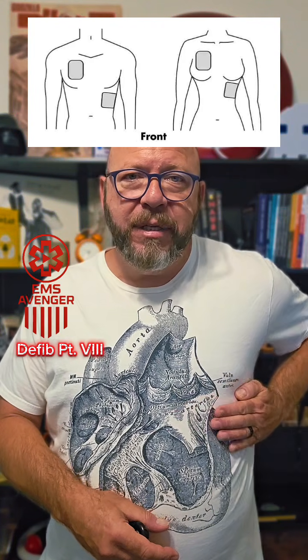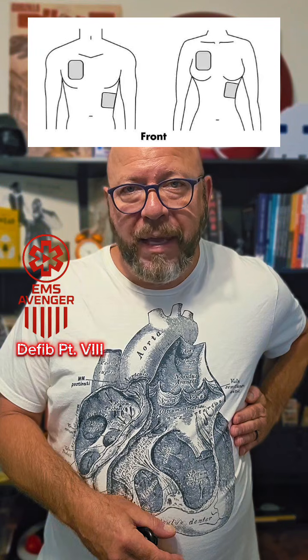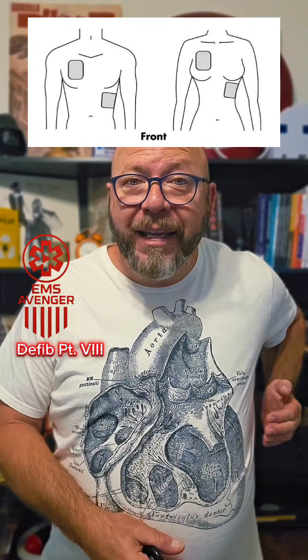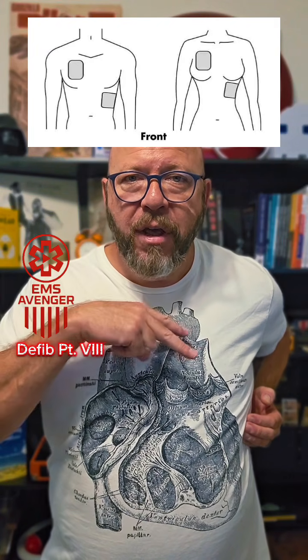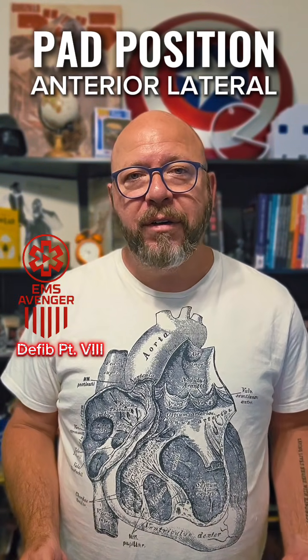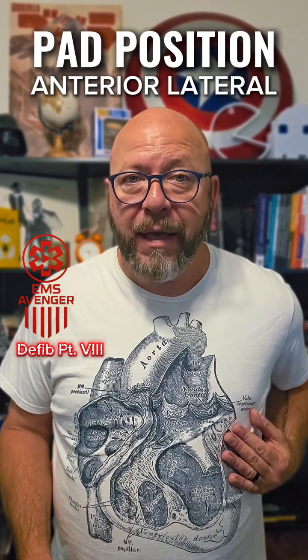That pad needs to be drawn back as far back as you can get it without rolling the patient. And the way to look at it is you want to consider that apical pad, or that lateral pad, to be a catcher's mitt that is catching a ball that is being pitched through the largest part of the left ventricle. This is what we call the vector. The defibrillation vector is the imaginary line that we can visualize going from one pad to the other.